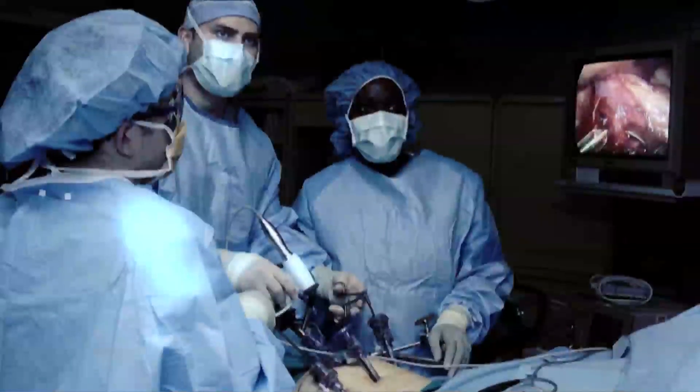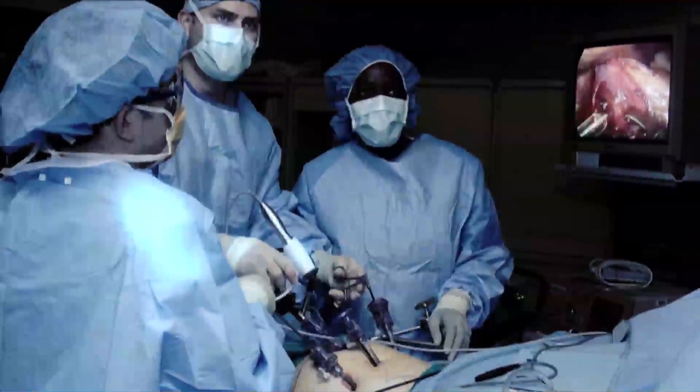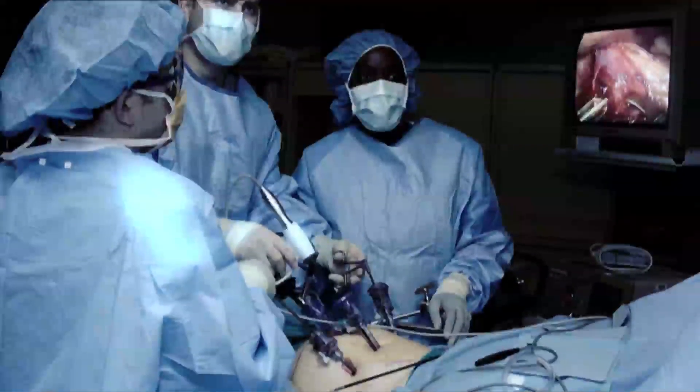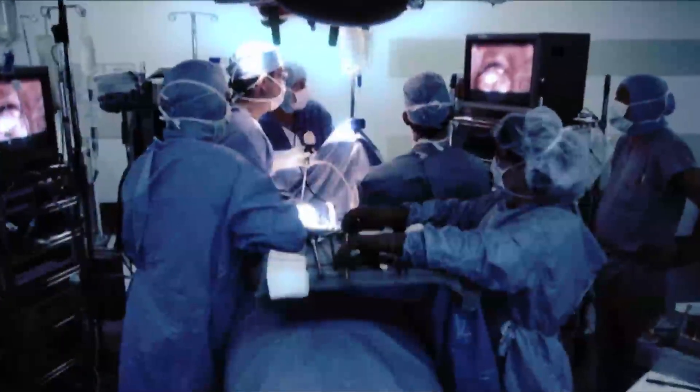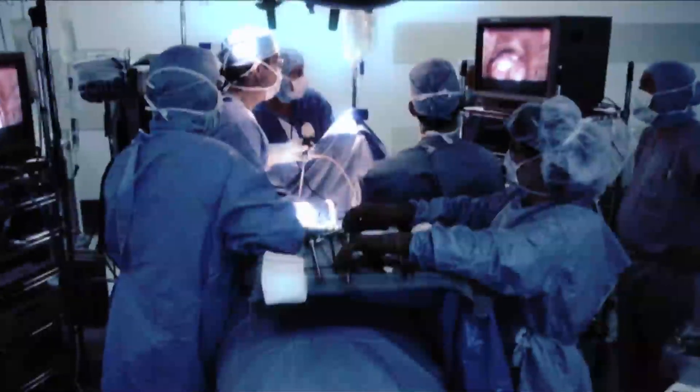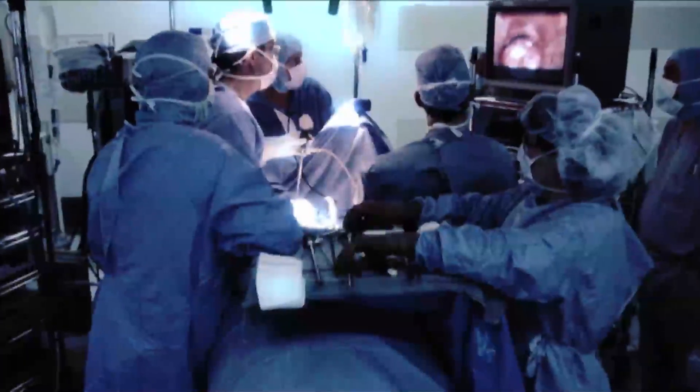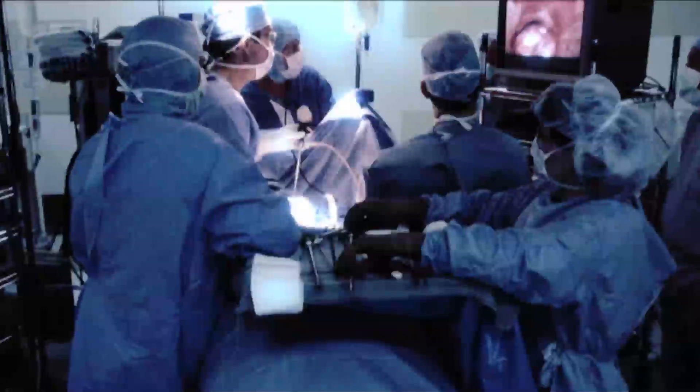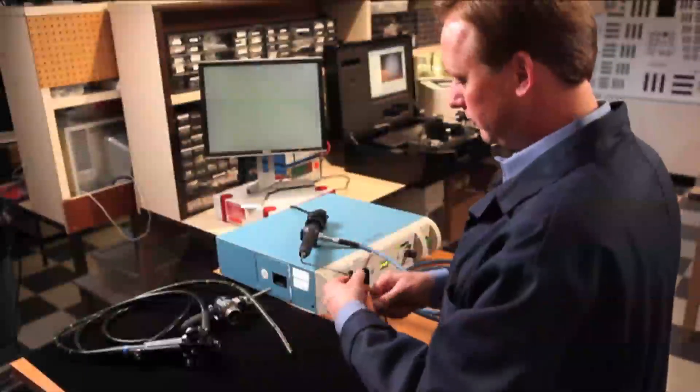Insufficient light during endoscopic surgery can create an unsafe operating environment. Getting satisfactory illumination to the surgical site requires that all equipment operate properly. Diagnosing the source of insufficient illumination can be difficult and lead to costly operating room delays.